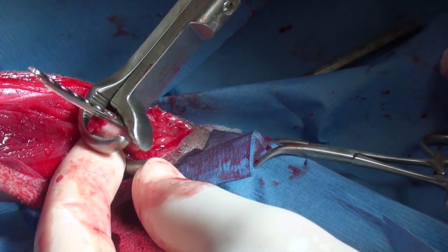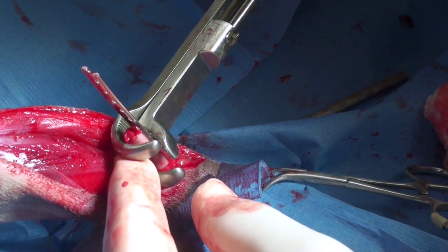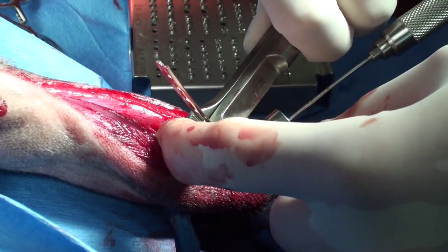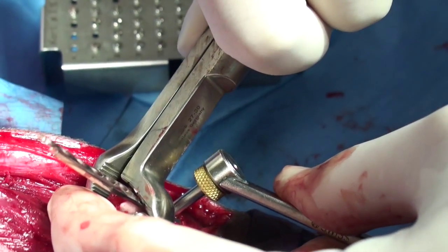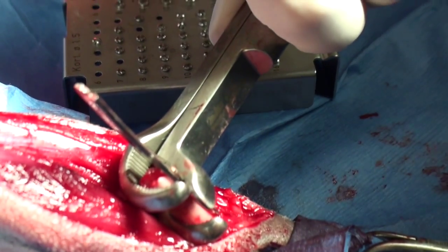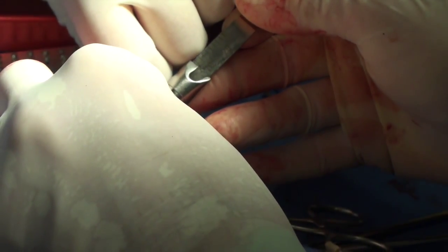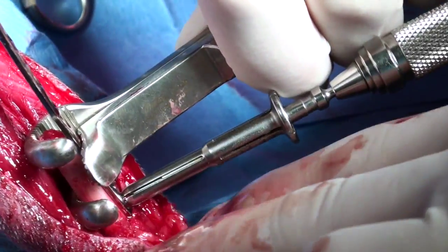Once this first hole is established, we can proceed to the rest of the holes and make it really easy. Once the first hole is done, we're pretty much done. We want to proceed with the first hole now. The first screw is already in position.